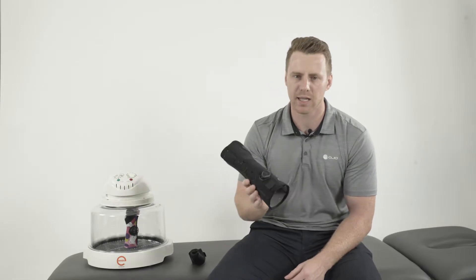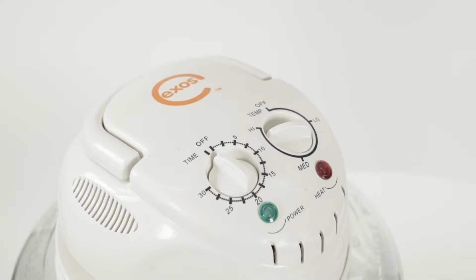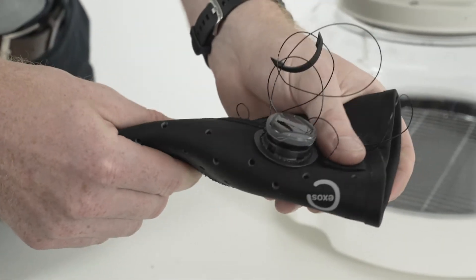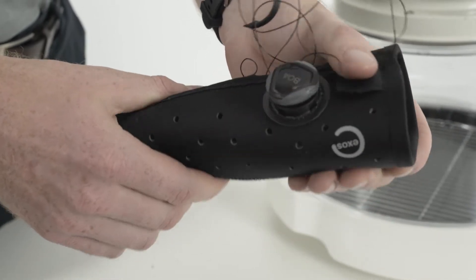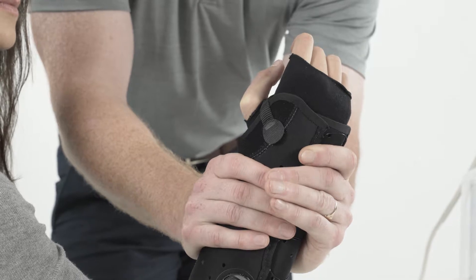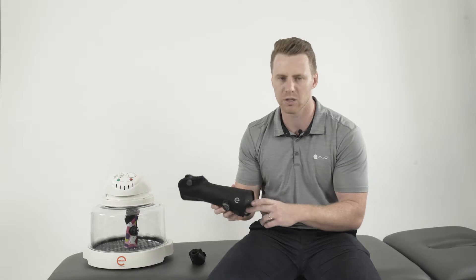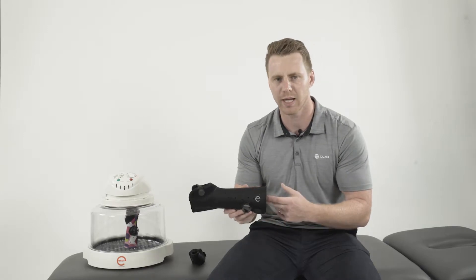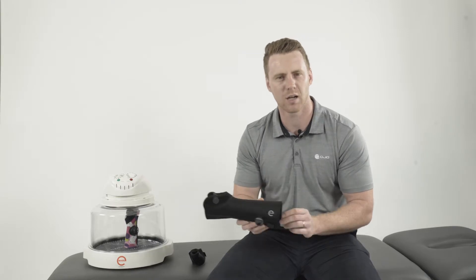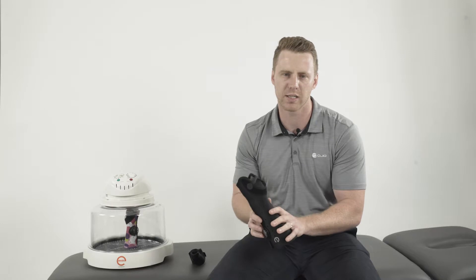The braces themselves are completely rigid but they're heat moldable, so when we put them into the oven for about five minutes they go completely soft — a neoprene-like material — and then slowly go rigid as you form them to your patient. In terms of what they're made of, there are three layers: an internal antimicrobial layer, a thermoplastic layer which provides the rigidity, and then an outer coating.